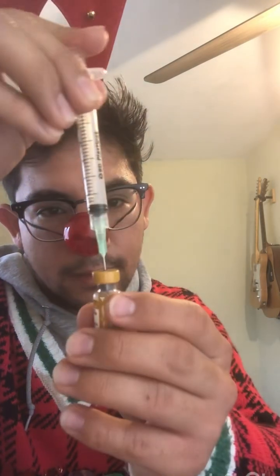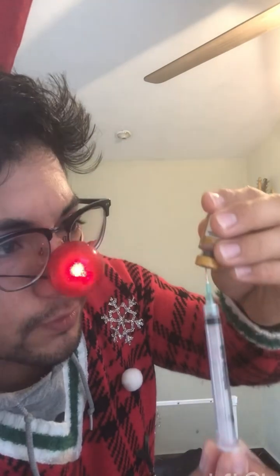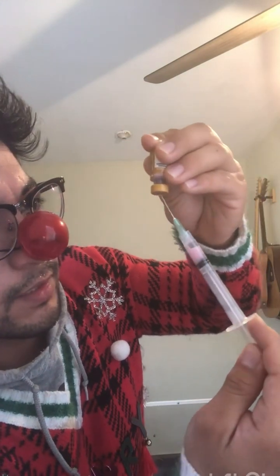You want to make sure that you use a new syringe for each puppy. Make sure you twist on the needle nice and tight so the medicine doesn't leak through the sides. We're gonna grab the sterile diluent first, then grab the medicine — the yellow cap one — put the diluent in there and mix it up. I'll actually pull the medicine out and flush it back in just to help make sure it's nicely mixed, but you don't have to do that — that's just me.